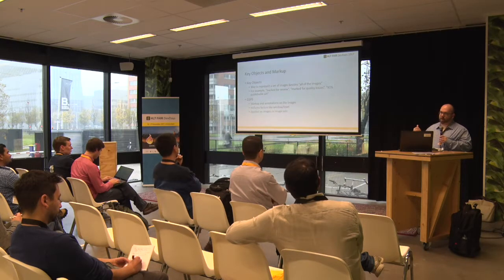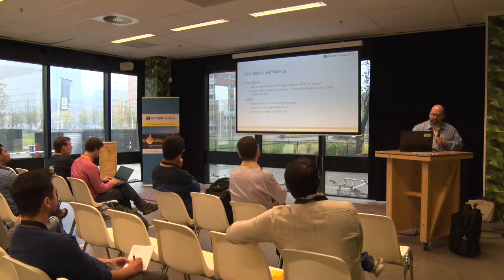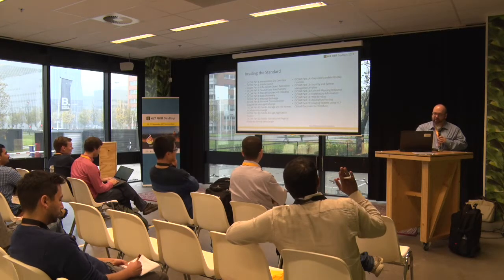GSPS, so when we draw on images, we don't destroy the pixels underneath. We use a layer on top where I can draw arrows and write text, draw circles and measurements and things like this. Also adjust brightness and contrast, flips and rotates, things like that. If you want to read the standard, if you've got that kind of time, yeah, absolutely.